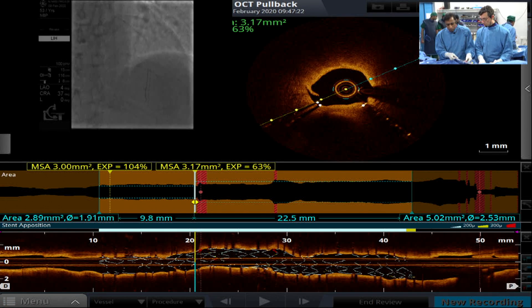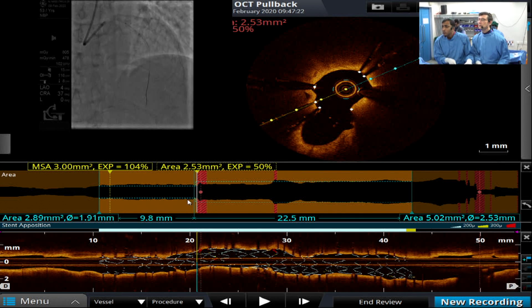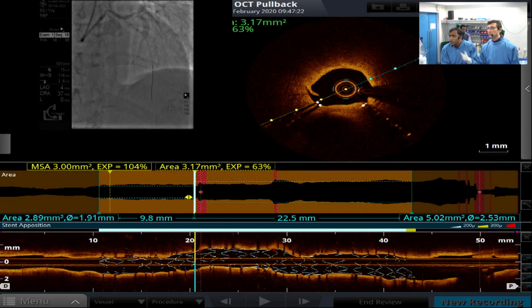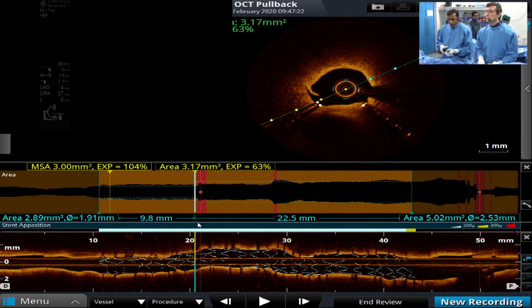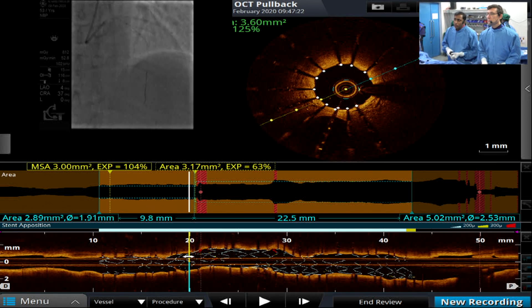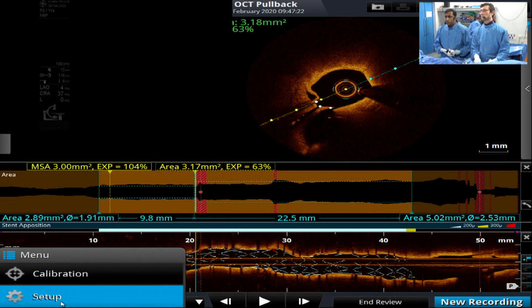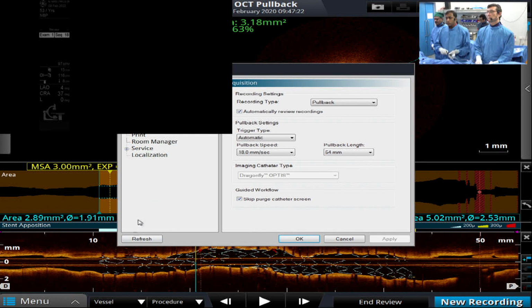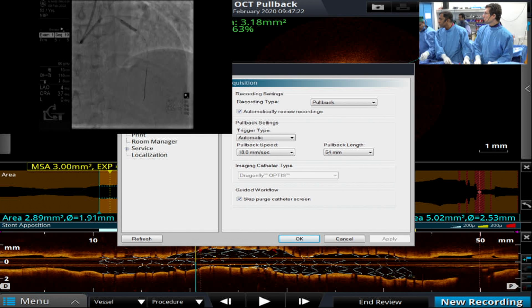Are you going to take a picture of this? Little proximal. I think it looks good. I understand the limitation of the software. Does it make any difference if we put it on a tapered reference, because the artery looks good. Okay. Perfect. I think we're done here.